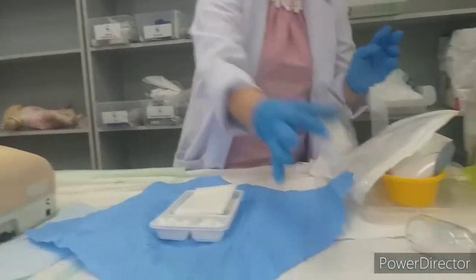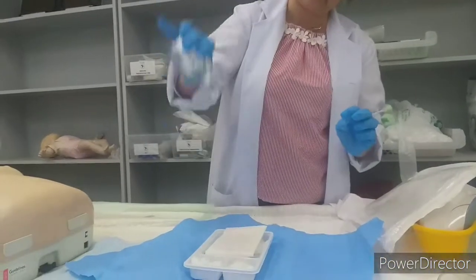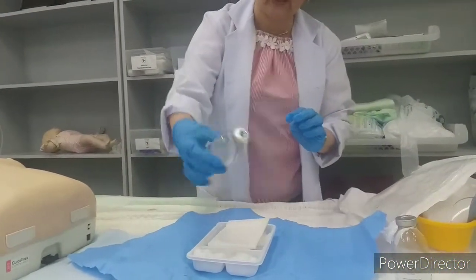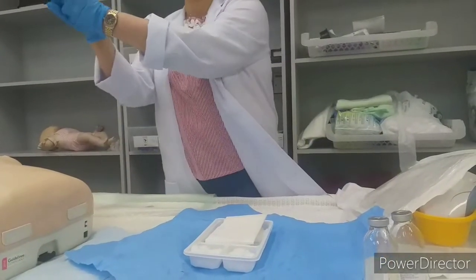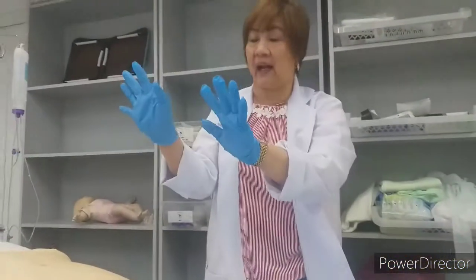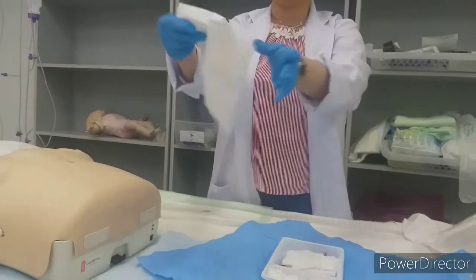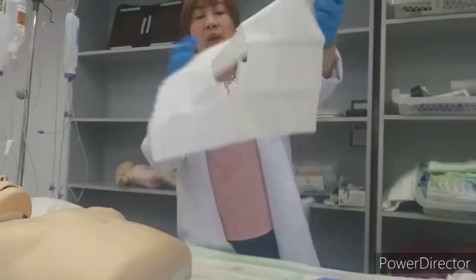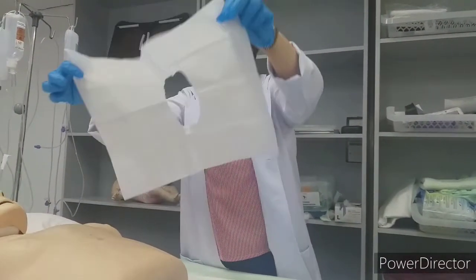Okay? So I will pour betadine here, keep it a little high. Saline solution here, a little higher. And I will change my gloves. Okay, assuming I change my sterile glove, so I will proceed. Take out, this is our dressing towel. Same way with the dressing towel, we have the absorbent and we have the plastic under.